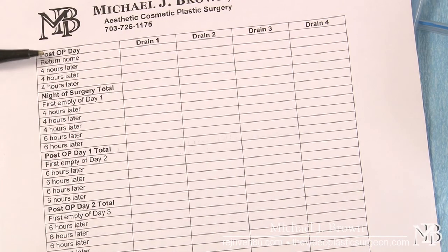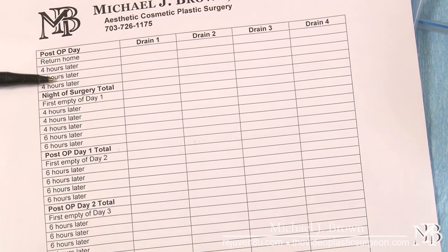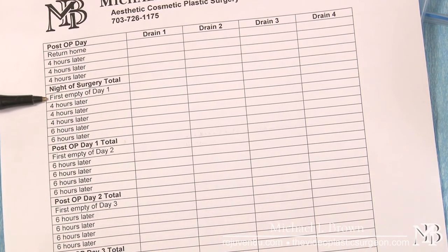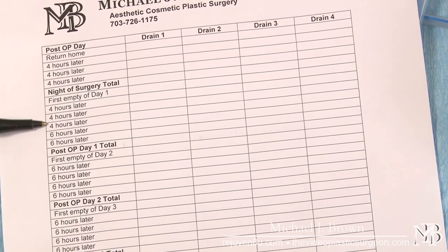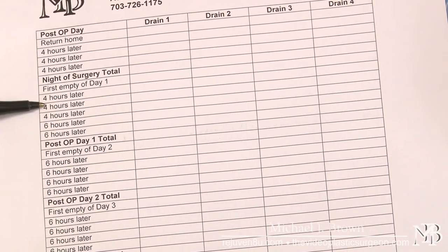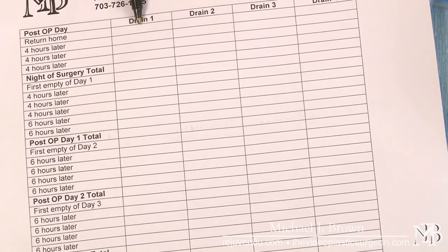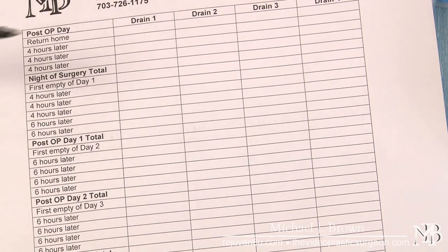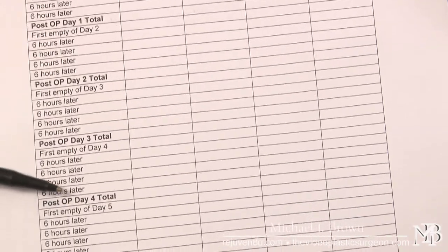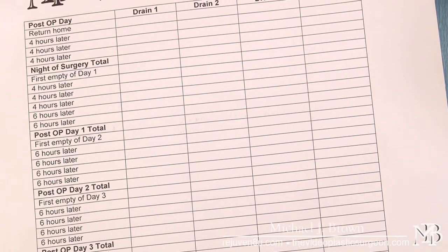That frequency is usually adequate to allow most of the fluid to come out. As you go further from surgery, the frequency changes to every six hours — so basically four times a day you empty the drain, and you write those values in the column and add them up every day. By keeping this post-operative record, we can determine when the volume has dropped to a safe enough amount to remove the drain without worrying about fluid collecting.